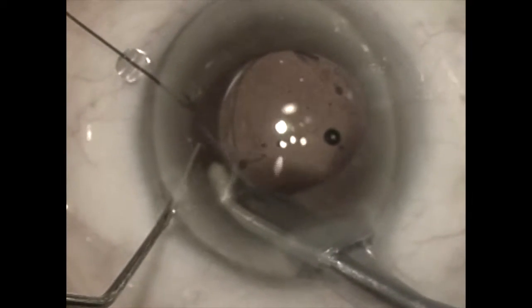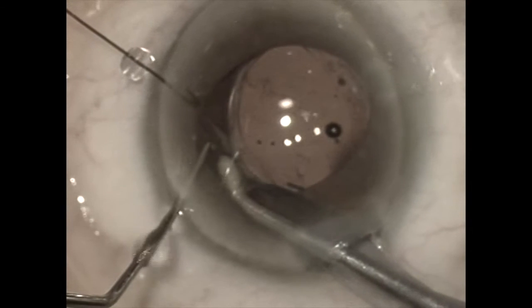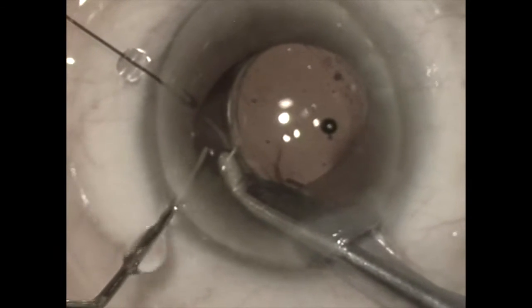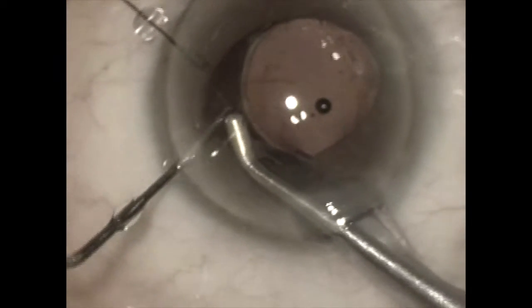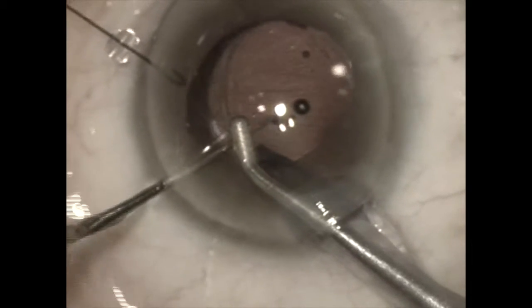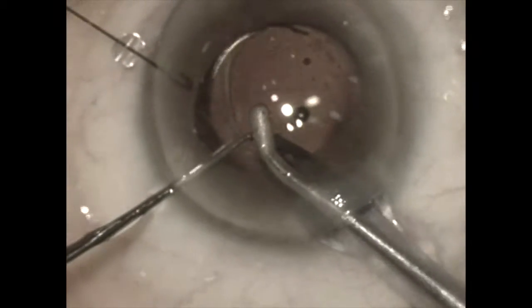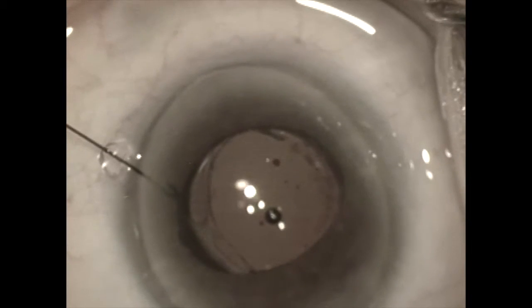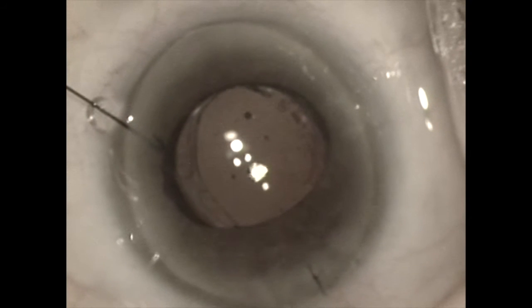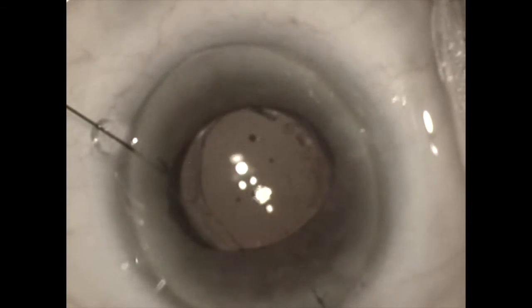Now I can reach the viscoelastic behind the lens without having the lens drop back into the capsular bag, because I want to keep it in the reverse optic capture position above the rim. The optic is still in the reverse optic capture position above the anterior capsule rim with the haptics in the bag.